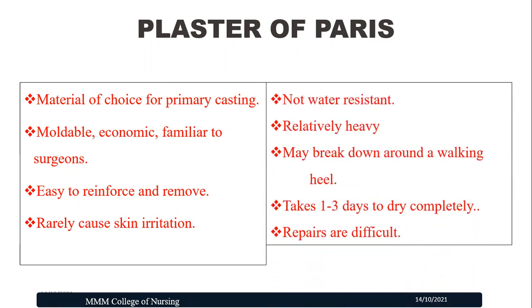It easily becomes wet. At the same time, it is very heavy over the body part. Sometimes it may break around a walking heel, especially when used in the leg. It takes 1 to 3 days to dry completely. At the same time, it is difficult to repair when it becomes wet or it is broken.